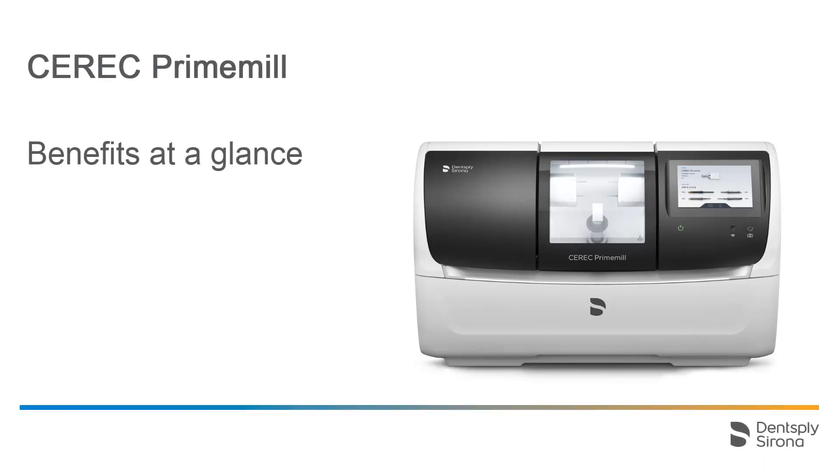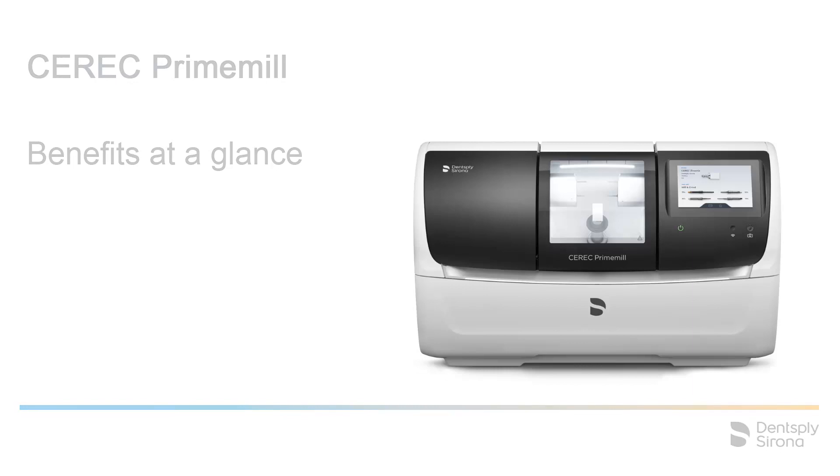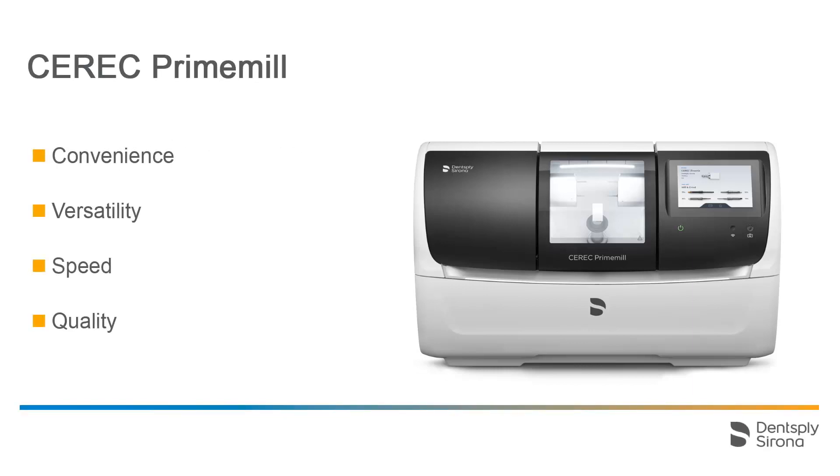Welcome to this video tutorial on the topic of CEREC Prime Mill. In this video, we explain the benefits of the new grinding and milling unit. The CEREC Prime Mill is distinguished by its convenience, its versatility, its speed and the quality of its output. Subsequently, we will look at these items in more detail.